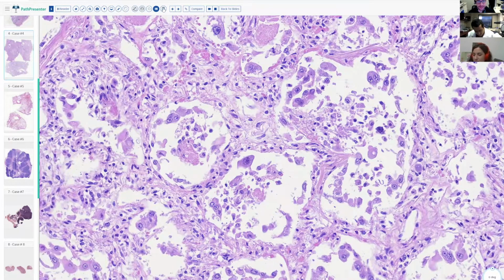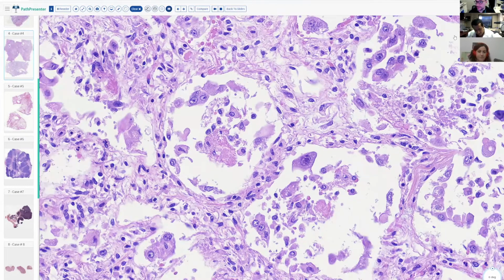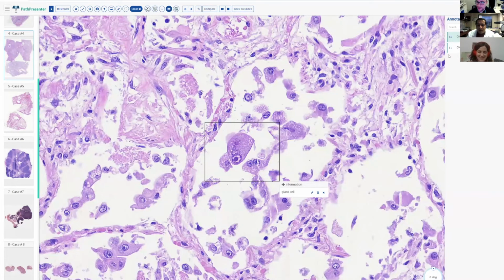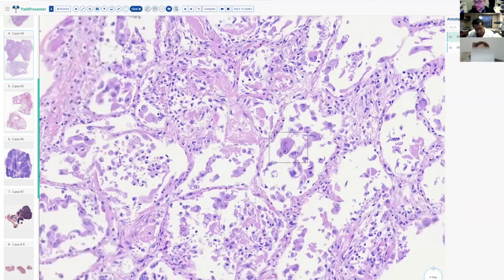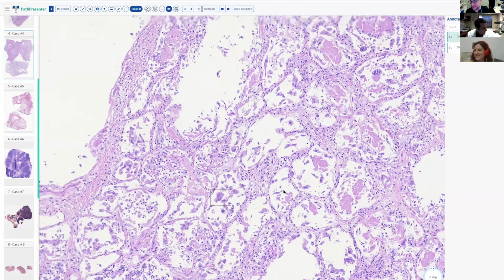Yeah, here, let me just find a... I thought I annotated these. I guess I did. There we go. I found some good ones. There's one there. There's one there. Okay. Do you guys have the 2 diagnoses? Yeah. We got pneumocystis and CMV. Yeah, perfect. Yeah, so it's good.